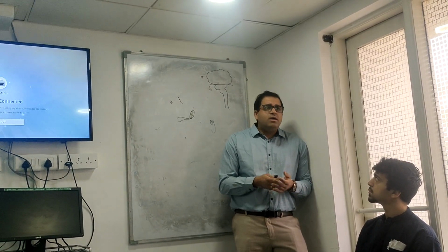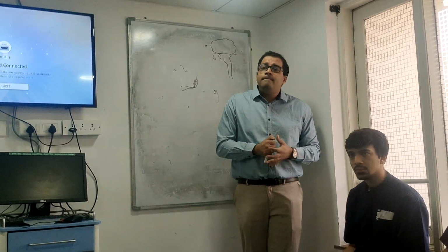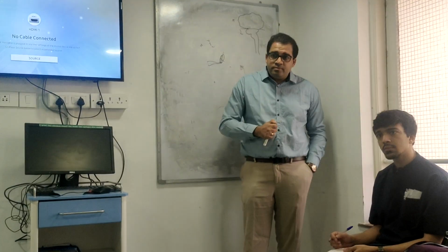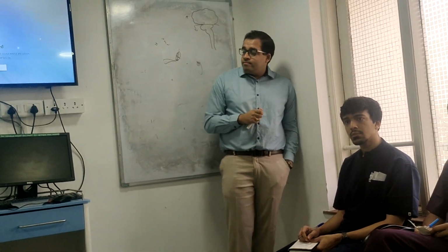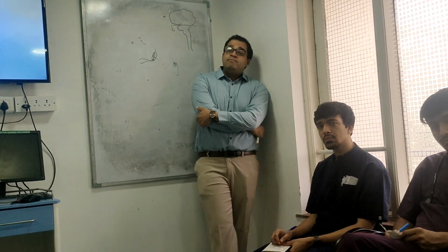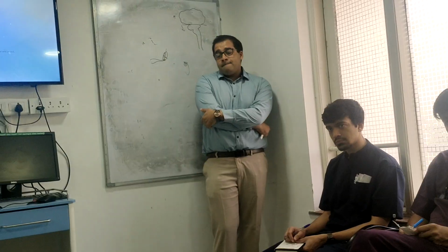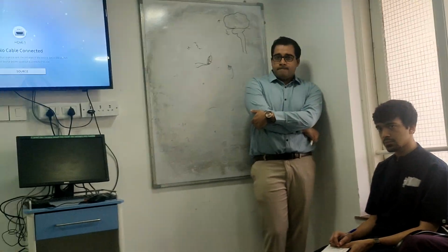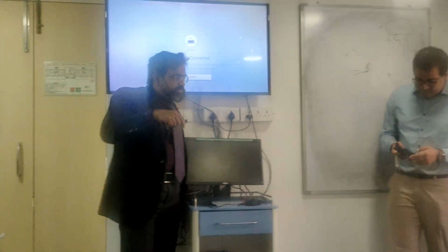Any other contaminants we can discuss. So what Dr. Shetty has explained is very important for all of us. We understood what blood culture is, very nicely explained. One thing to take away is that it's very essential that we set the blood cultures in time. That is most important. Whatever lytic agent you have inside the system will do a job but not a good job. That's why it's important to set these cultures.